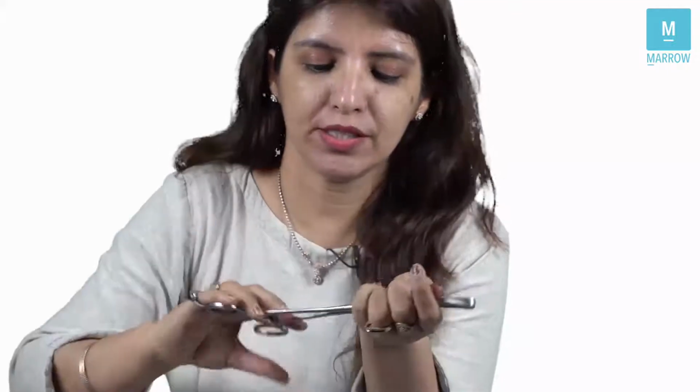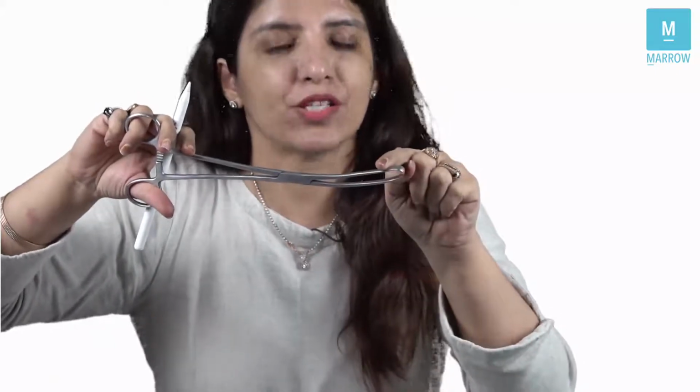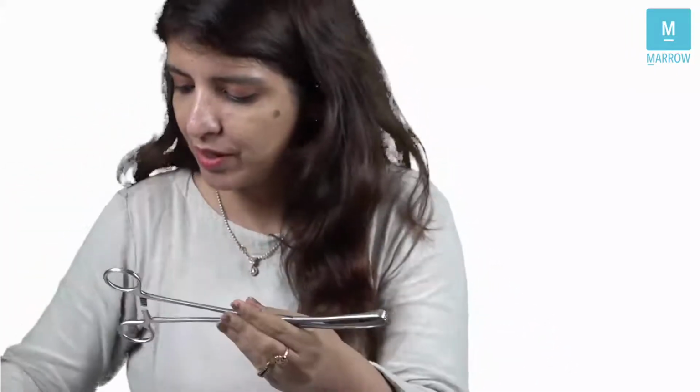So, this is a vulsellum. Again, you have a ratchet lock. Then, at the anterior end, look at the blades. They are curved. That's a concavity which is present there. I'm just now going to apply it and show you that when you are going to apply the vulsellum, the concavity should face upwards, right? So, this concavity should face upwards. Then, on opening at the tip, you see 4 to 5 rat teeth.